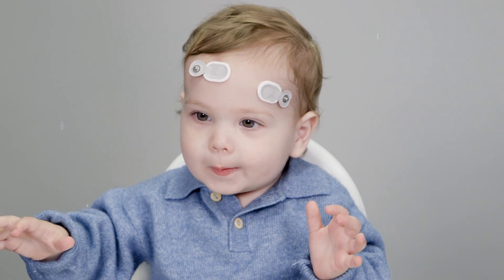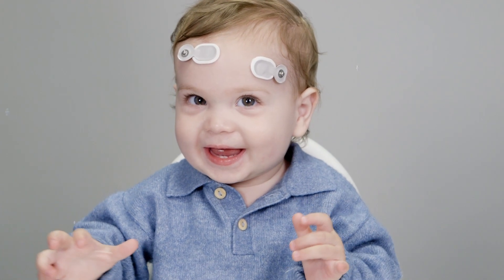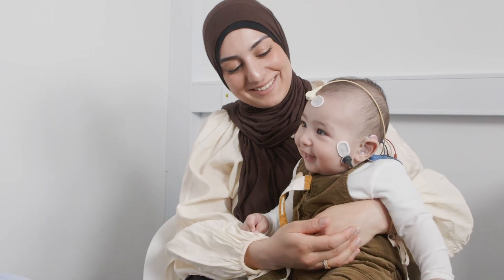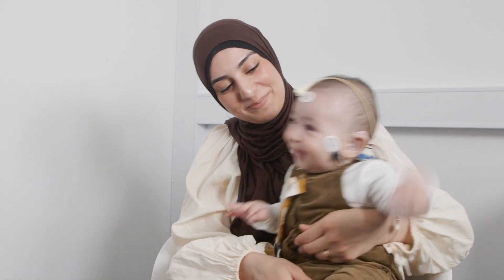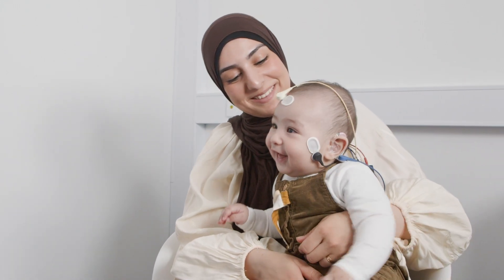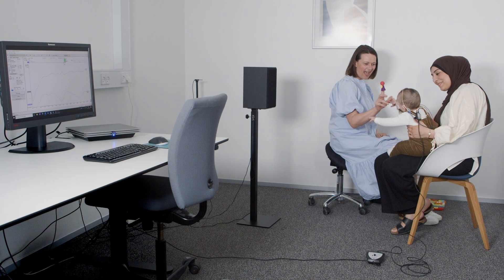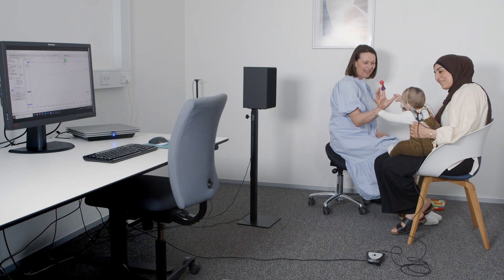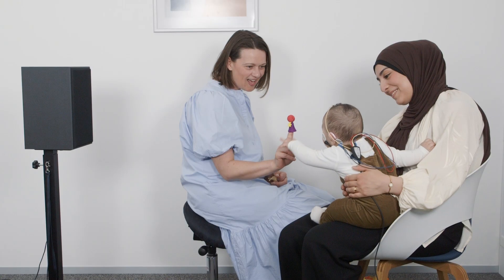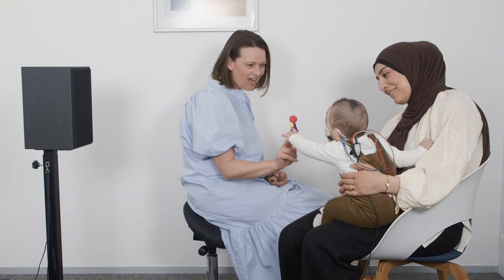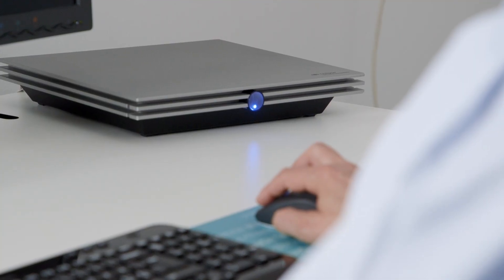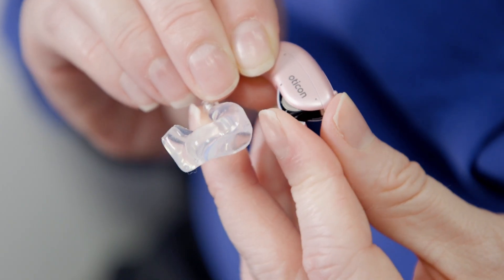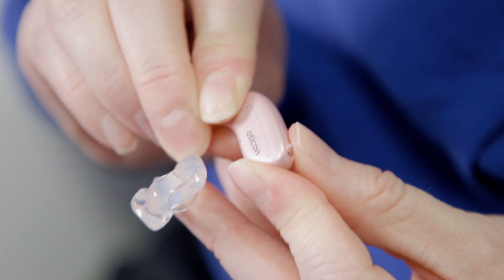This is how to perform aided cortical testing on a young child or infant. Unaided cortical testing is performed in the same way, only without the hearing devices in place.